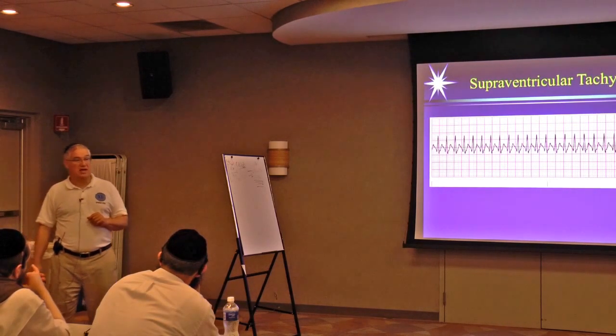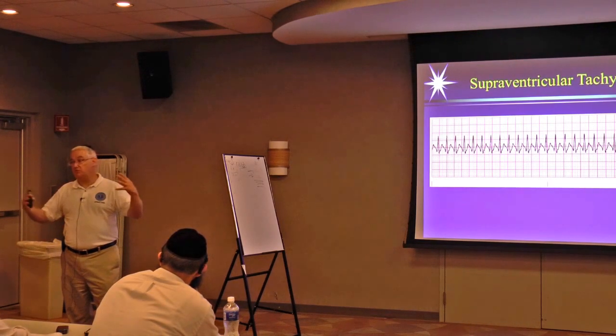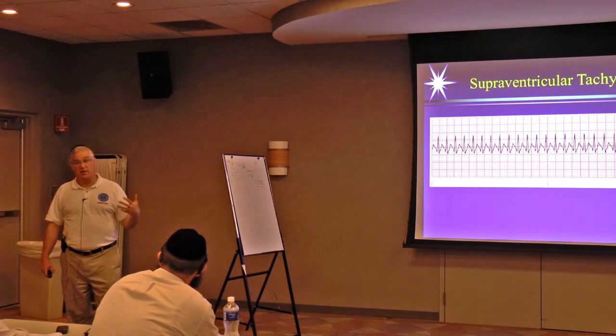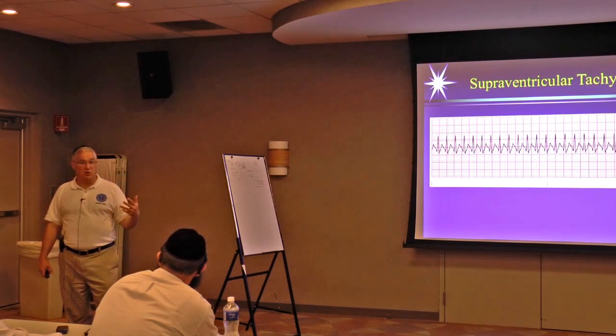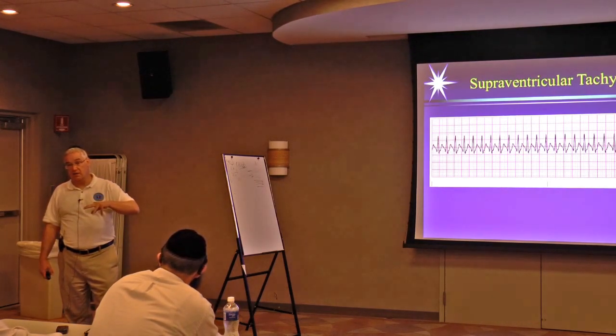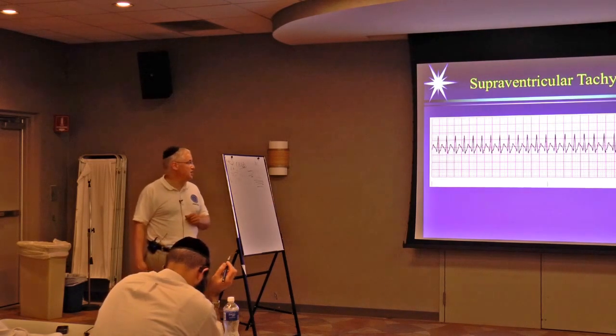The person who's in sinus tach, if they were scared, they're going to say to you, something frightened me. If they were dehydrated, what are they going to say? I had vomiting and diarrhea for 3 days. Okay? In other words, if it's compensatory, you're going to be able to hear in the history that's telling you why it's compensatory. Okay? So a lot of times history plays a role, not just looking at the EKG.